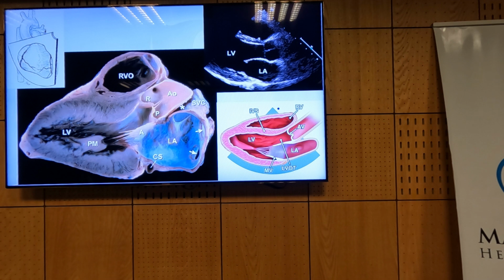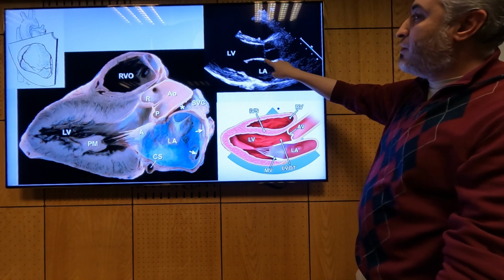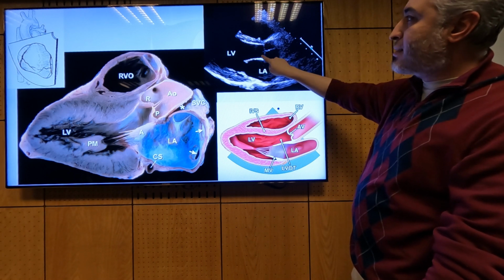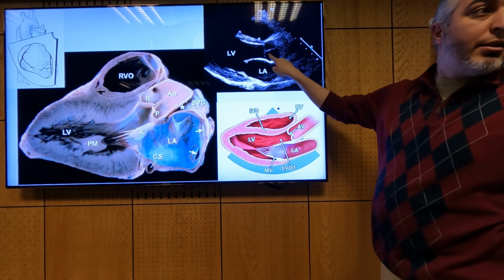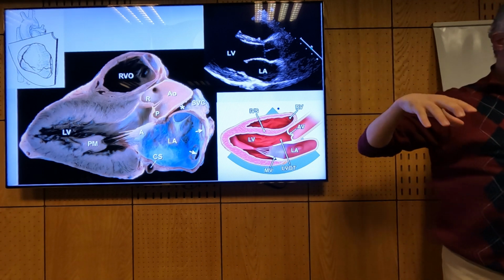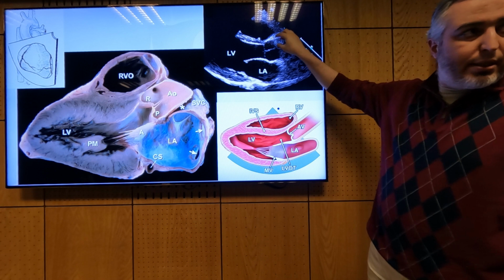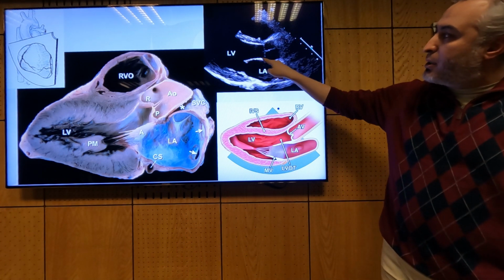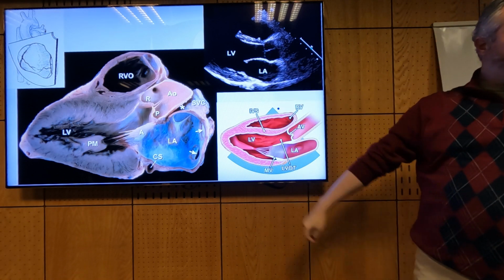What is the aortomitral continuity? Here. You can see that this is the anterior mitral leaflet, and it gets attached into the aortic valve without muscle in between. So this is muscle. You do not get this thick muscle here. In some diseases where you get the double conus, you can actually see a muscle intervening between whatever root is here and the mitral valve. Normally you do not get that. So this is anterior mitral leaflet, and this is the aortic valve, and there's no muscle here.